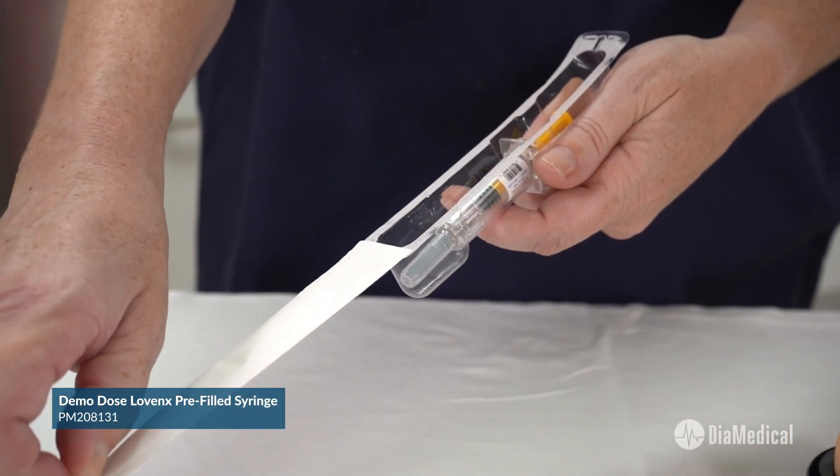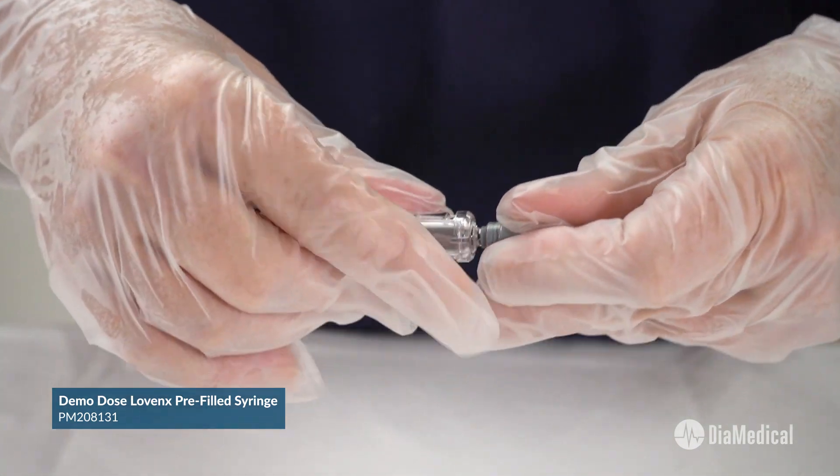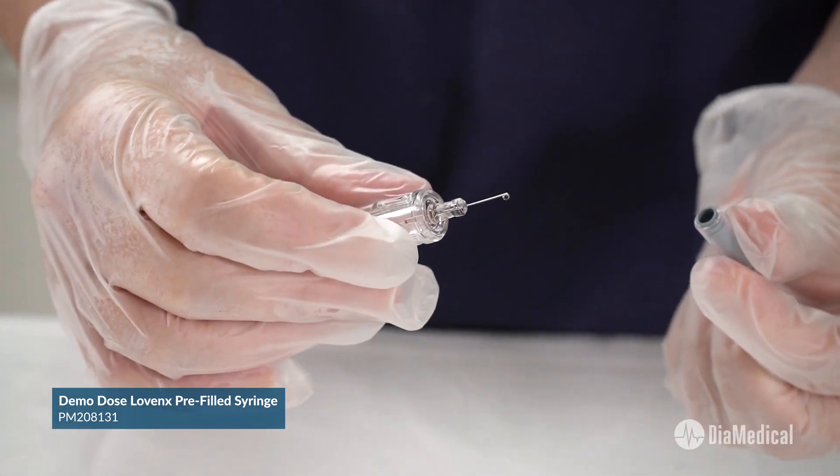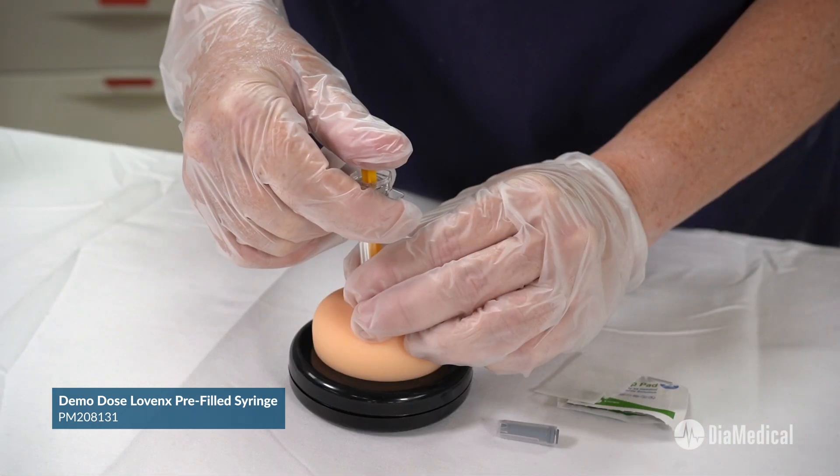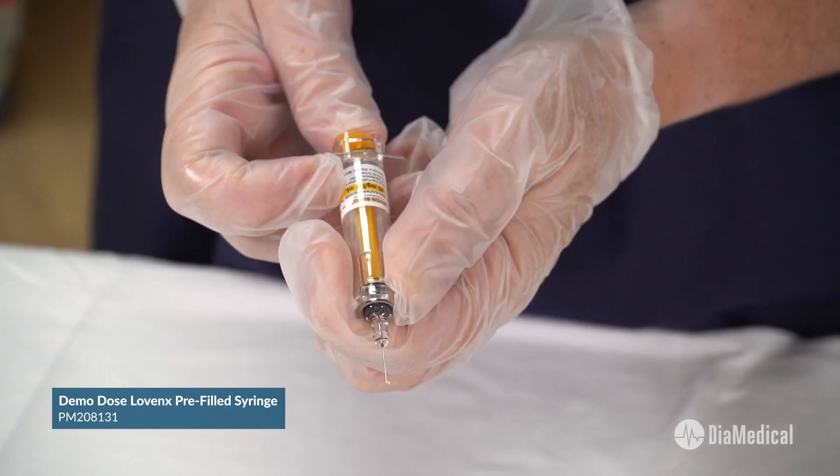Demo-Dose Simulated Lovenox allows students to practice using this unique pre-filled syringe. It features the characteristic bubble as well as the same safety mechanism as its clinical use counterpart.